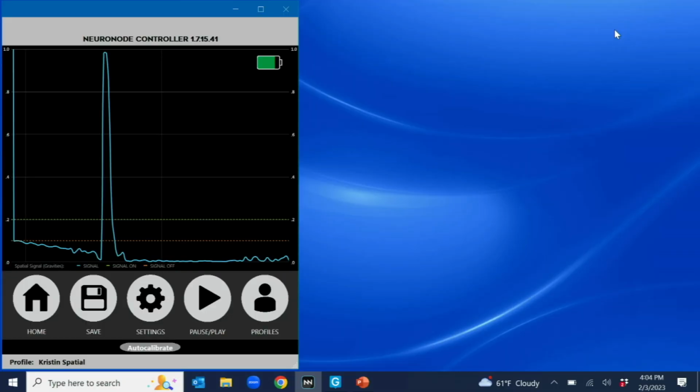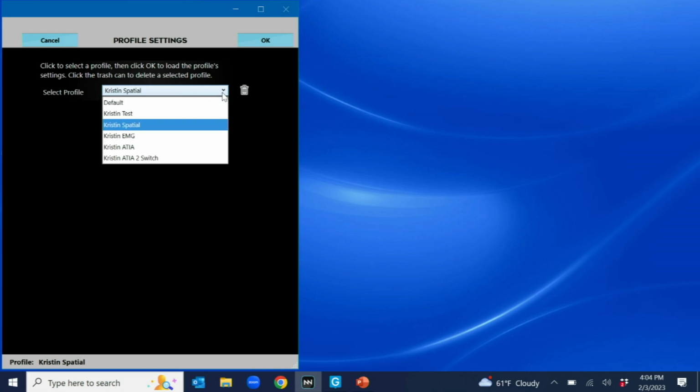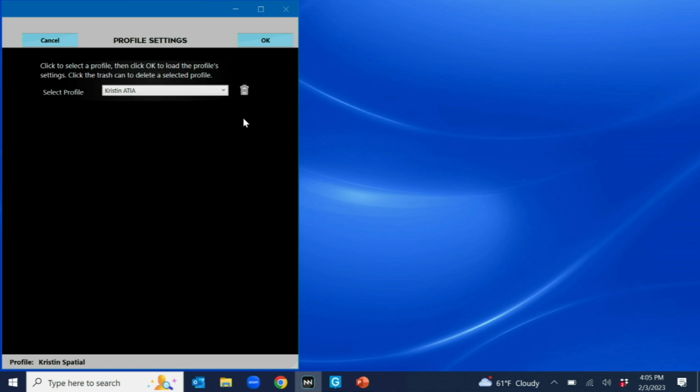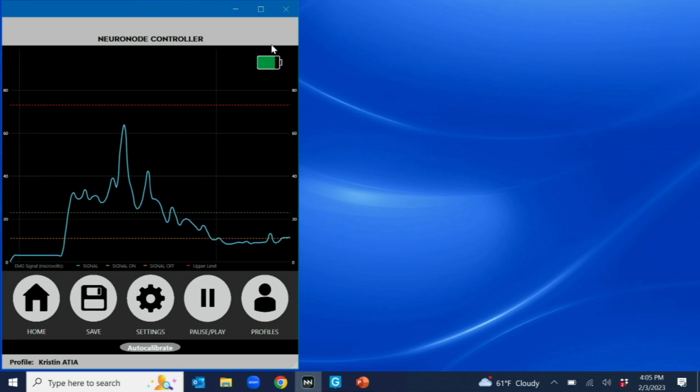So what I'm showing you here is what we call the controller app, and it's just a piece of software that helps us get the NeuroNode set up specifically for one individual. Once we've set it up, we really don't look at this very much, but it gives us a way to help fine-tune the way the NeuroNode works. So profiles are easily accessible here, and I can save. I don't think we've tested the upper limit, or we've found the upper limit of how many profiles we can save. So I can have a variety of different things saved here. I am in spatial mode right now, so it's looking at changes in the position in space. But I'm going to change to this ATIA profile that I created earlier today.